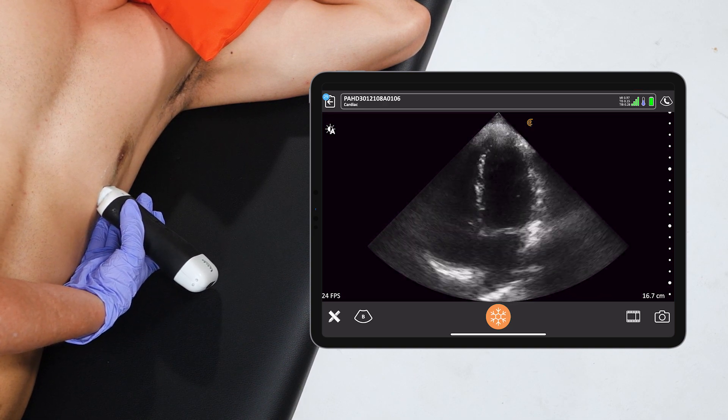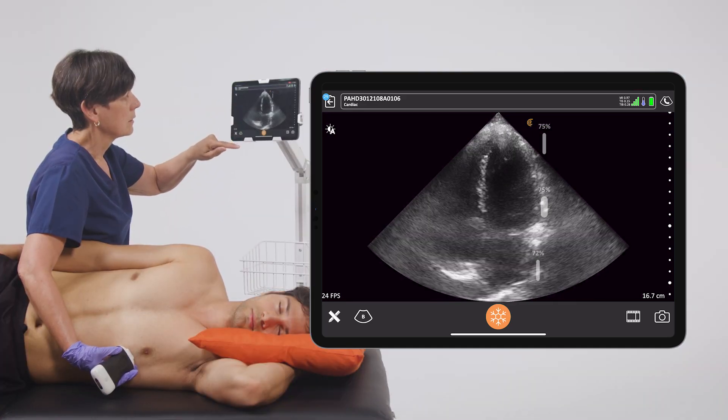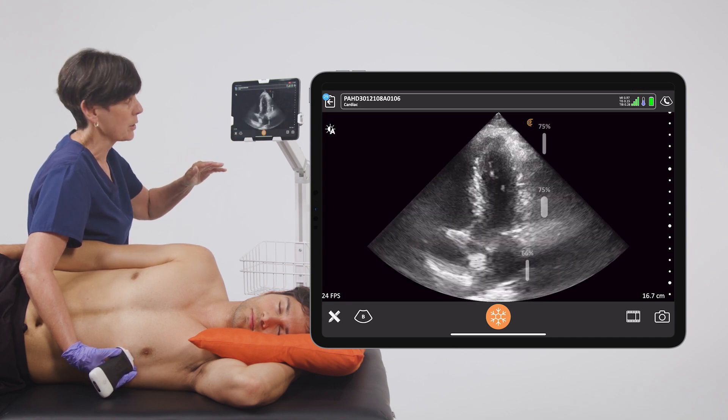And rock the scanner just a little bit until we can get the longest view of the heart. And sometimes that requires pressing a little bit on a rib.